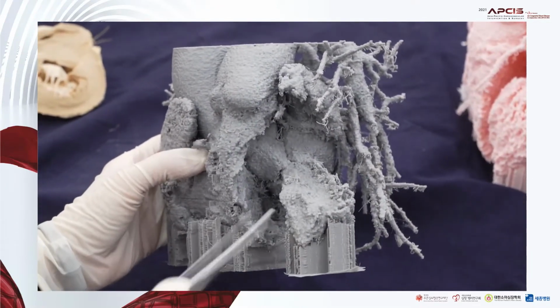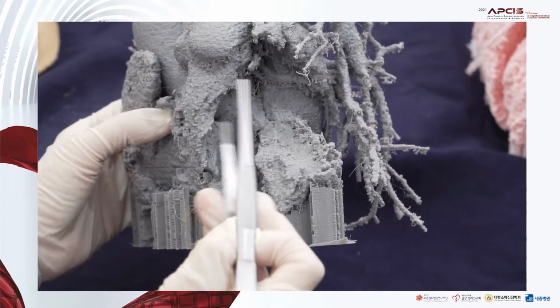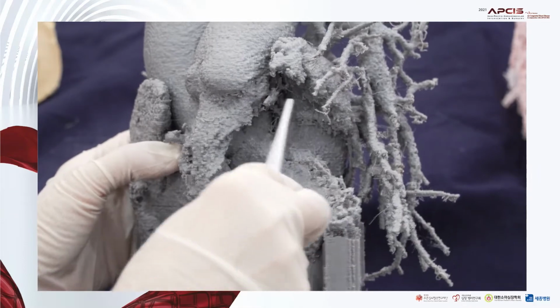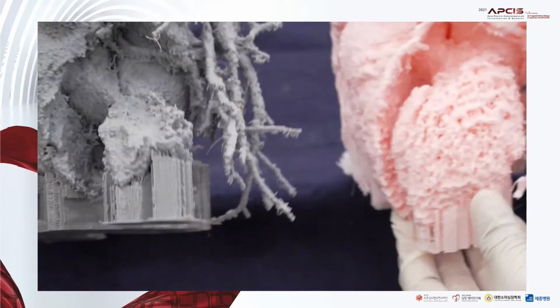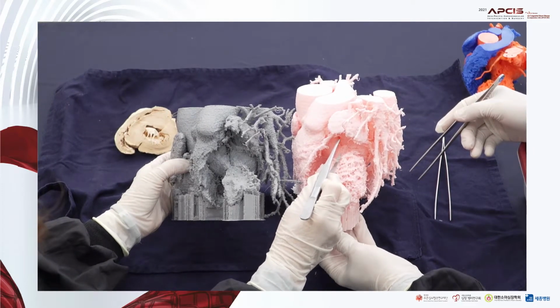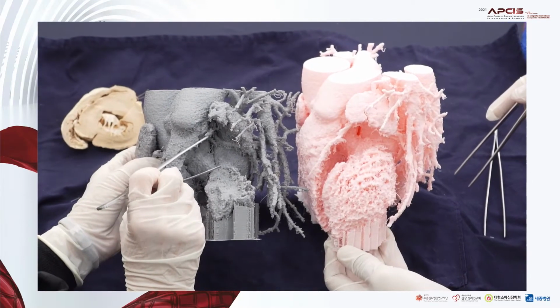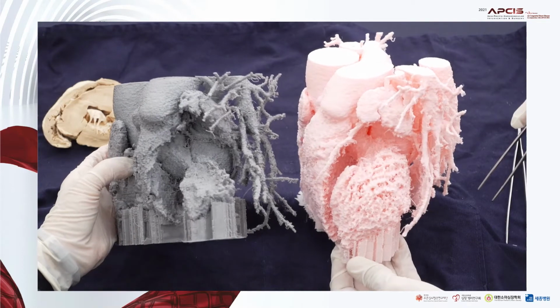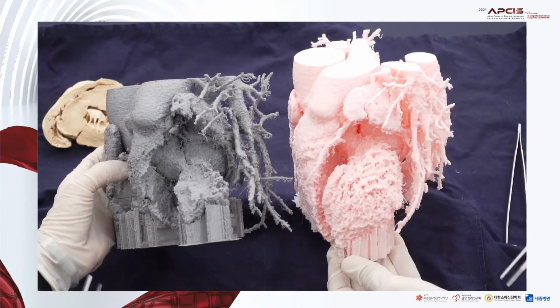So now the cavity part of the left ventricle is small because it's systolic phase, and you can recognize the much more thickened myocardium part here. So we can compare with the diastolic phase. Yeah, zoom out, please. More. Okay. So the thickness of the myocardium in diastole is like this, and here in systolic phase, the ventricular myocardium is much more thickened, contracted. So its ejection fraction is very good. This is diastolic volume and this is systolic volume. Yes. Okay.